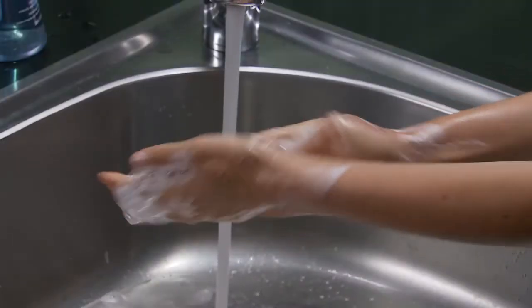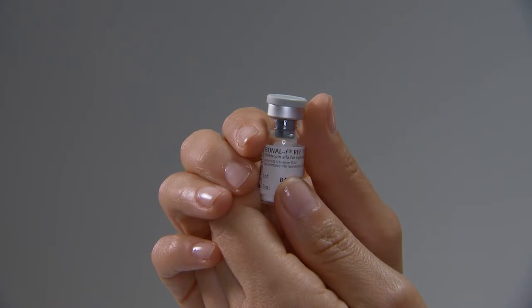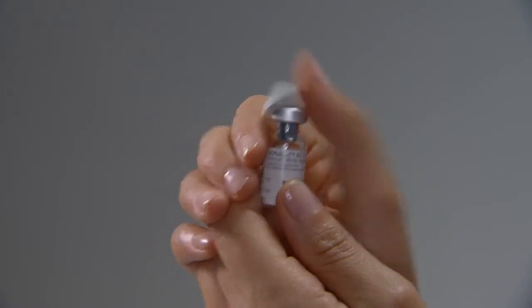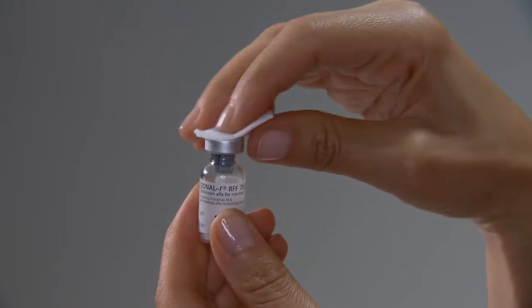Wash your hands with soap and water and make sure you are working on a clean, flat surface. Step 1. Mix. Using your thumb, flip the protective plastic cap off of the Gonal F RFF vial. Wipe the top of the bottle with an alcohol swab.